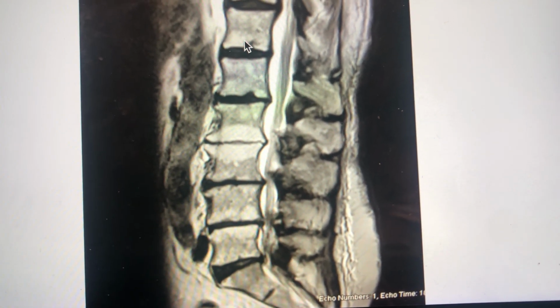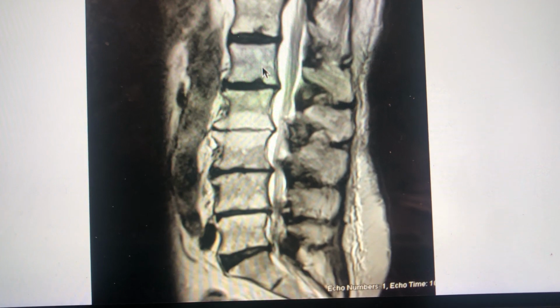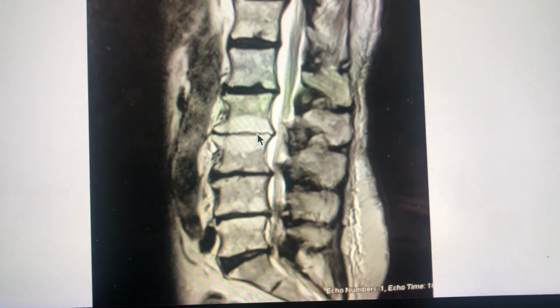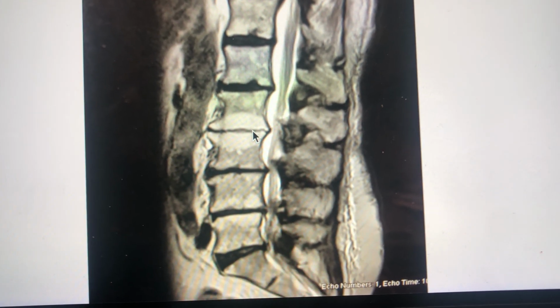We call this spondylosis with all the degenerative changes. She gets relief from spinal decompression. It's not going to open this up significantly, probably not in any visually appreciable way, but symptomatically it makes her feel better. And she's not a good surgical candidate.